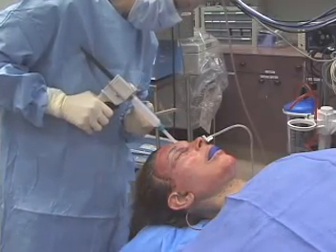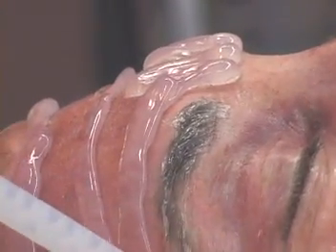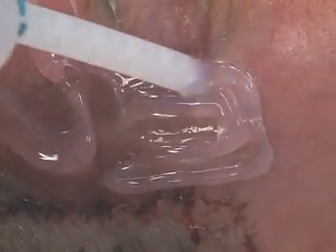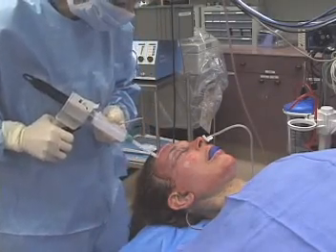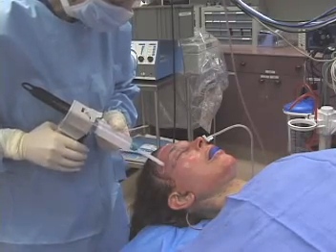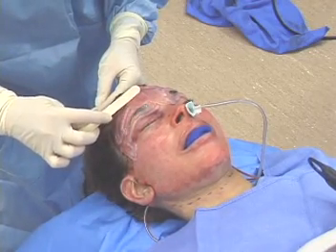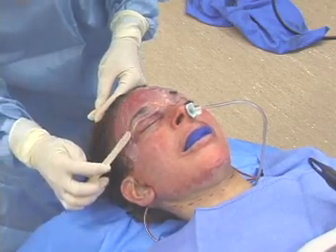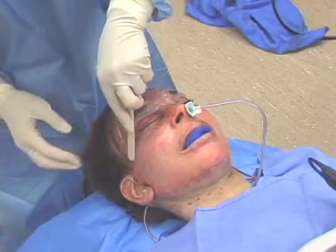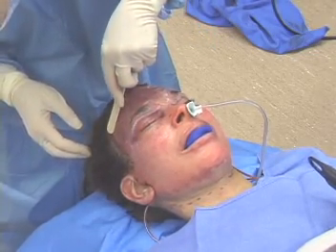The application process is extremely simple. The silicone is applied to the face through a special applicator gun. A medical grade silicone and a catalyst, each in a separate cylindrical container, are attached to the applicator, which features a single delivery tube. The catalyst activates the silicone as it is applied to the face after laser treatment. LaserSeal is evenly distributed across the face using a spatula or a gloved finger covered with SerjaLube. The gel-like silicone admixture adheres to the face, solidifying into a flexible membrane within 5 to 20 minutes after application. This allows adequate time for molding of the dressing within a workable cure time.